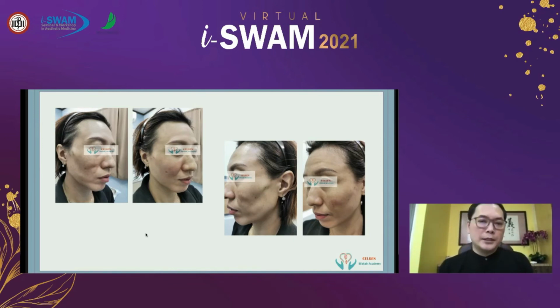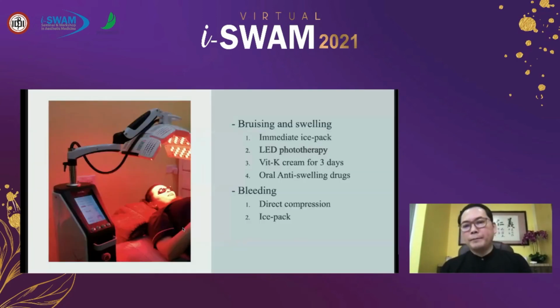This is the tip. So this is over pulling. Never over pull, as it causes all these issues. Even though the patient comes back after a week, you can still manage it by injecting a local anesthetic and doing it. This is the best LED light.